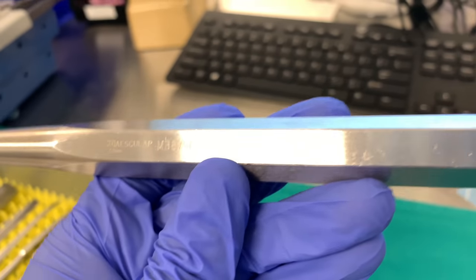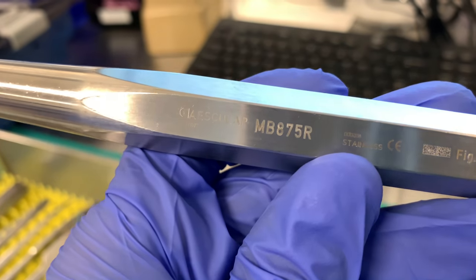This one we got 875 — it's going to be right there. It looks clean.